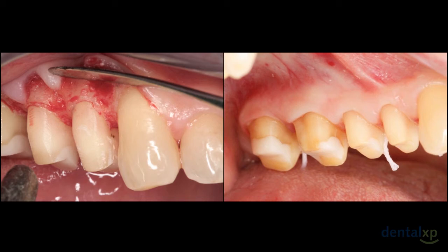You'll also notice that all the root surfaces are perfectly smooth. There's no CEJs remaining, and any irregularities have also been treated. Now let's just address tooth number 5. Notice the perfectly smooth root surface and no longer any concavities. This would be a very easy area to maintain.